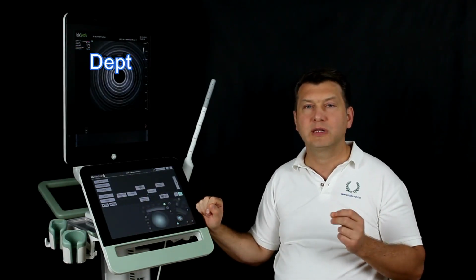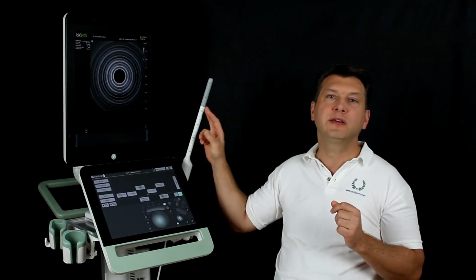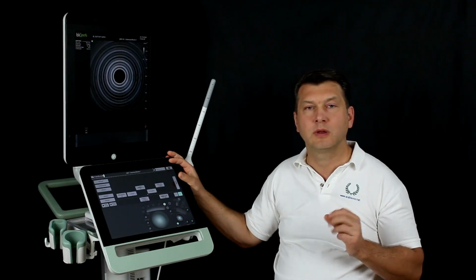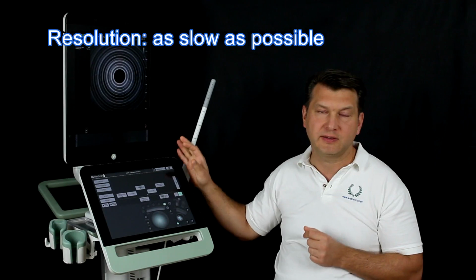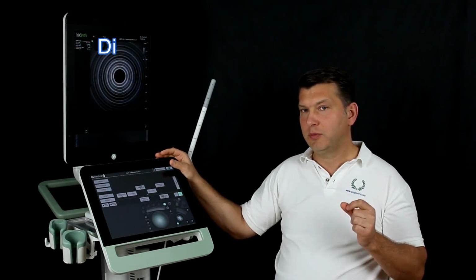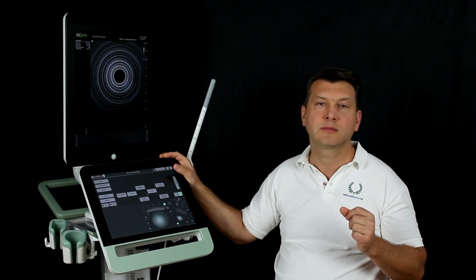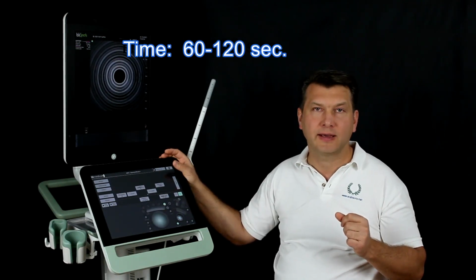Depth approximately 7 cm. Width, if possible, 6 cm or complete lesion. Resolution as low as possible. In this scanner it can remain in standard position. Distance 0.2 mm, as low as possible. Time 60 until 120 seconds.